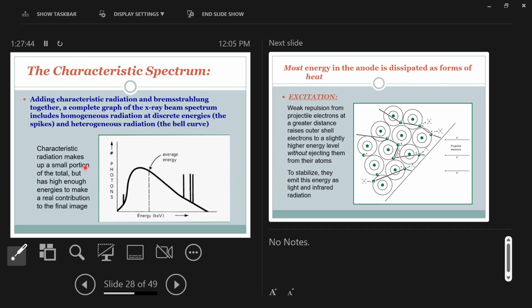We build X-ray units basically using the same type of material because it produces a consistent beam. Your X-ray machine and my X-ray machine both use tungsten anode faces because we know the type of radiation that's produced with tungsten. We know what its characteristics are. We know the characteristic X-rays it produces. We have consistency between yours and mine, right?